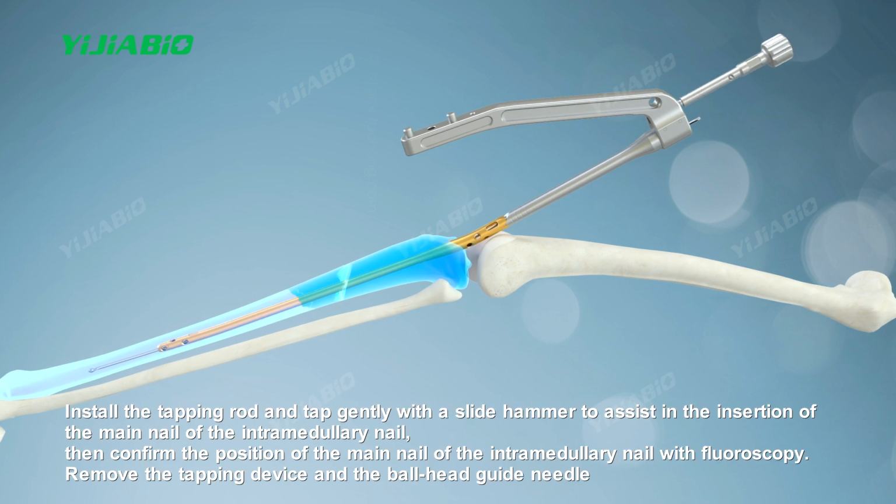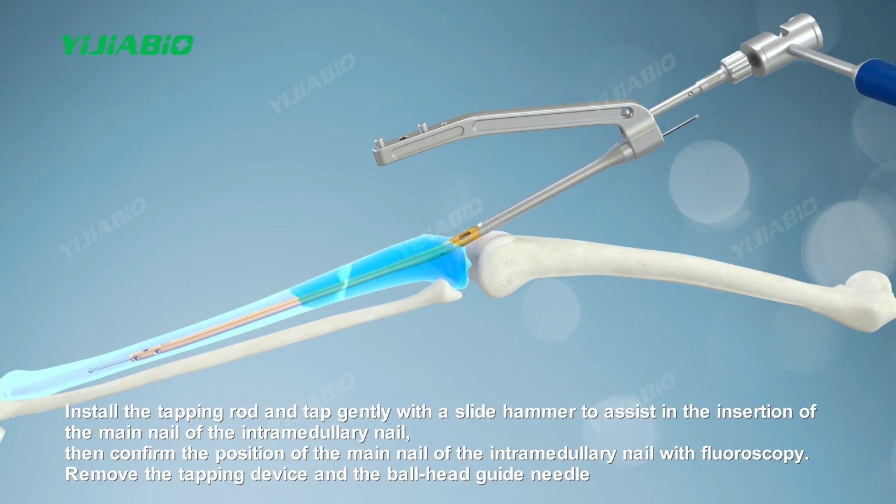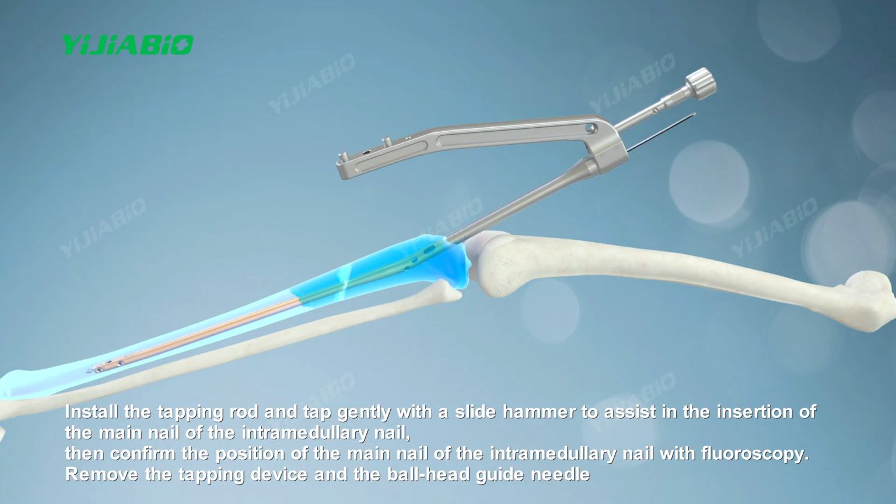Install the tapping rod and tap gently with a slide hammer to assist in the insertion of the main nail of the intramedullary nail. Then confirm the position of the main nail of the intramedullary nail with fluoroscopy. Remove the tapping device and the ball head guide needle.